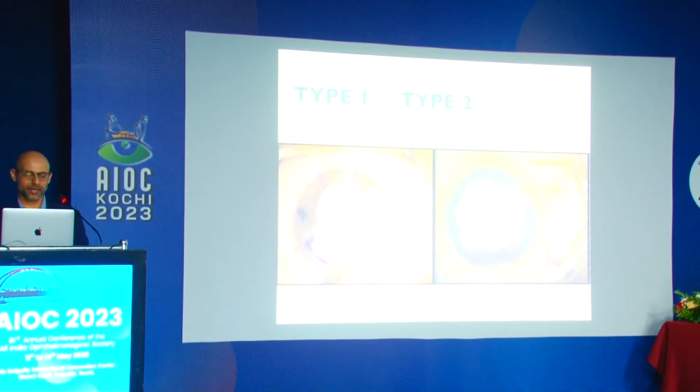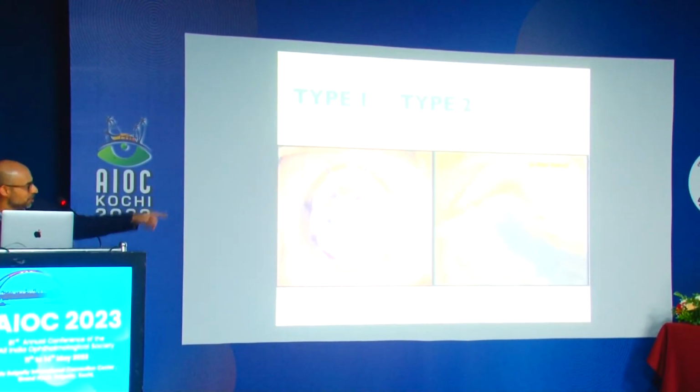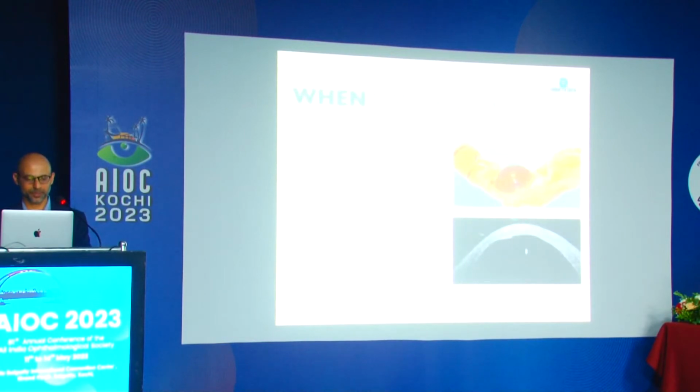You can see initially we're getting emphysema. Left one is a type 1 bubble, and the right one you can see we're getting emphysema, and then we get a water bubble. I'm not sure if you can see it on the video there, but after we excise the stroma, you can see that little bubble outside. That's the type 2 bubble.